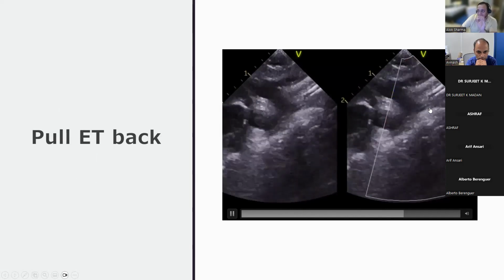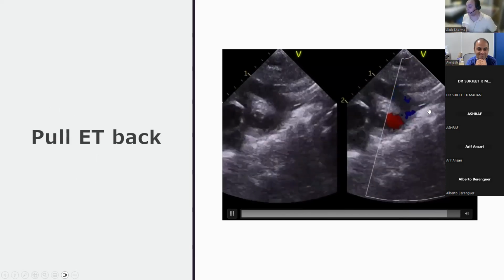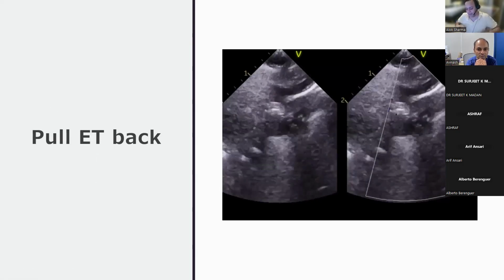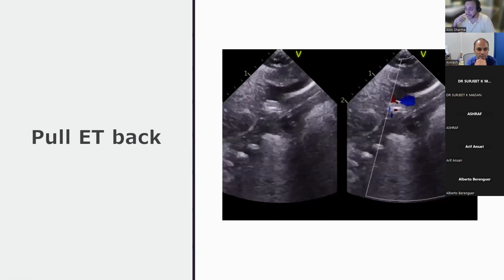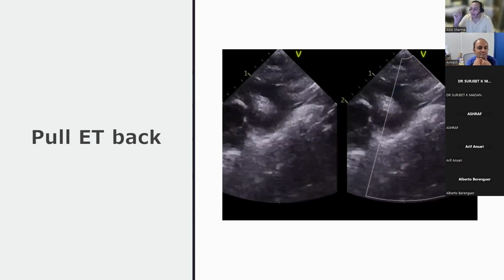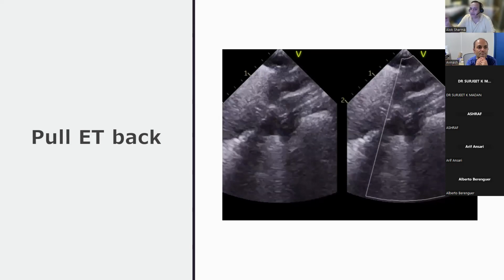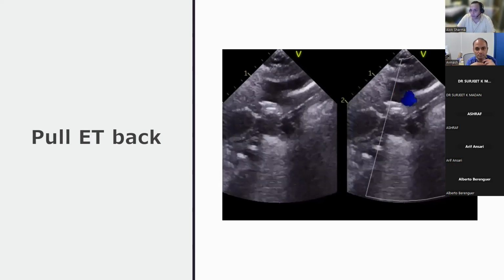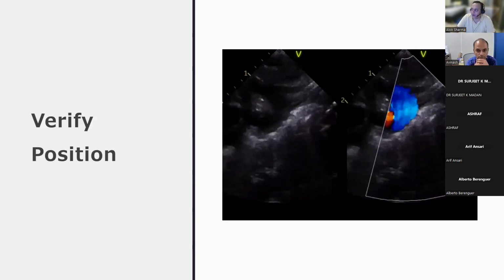But be very cautious. This needs a lot of skill, and in extremely preterm babies, I'd be very cautious. I'd be doing it looking at the markings. Now, you could argue that you can make this diagnosis by just looking at where your tube is at the position of the lips. But in extremely preterm babies, even half a centimeter can make a big difference. So this is just an example of how we've used lung ultrasound alongside airway ultrasound.